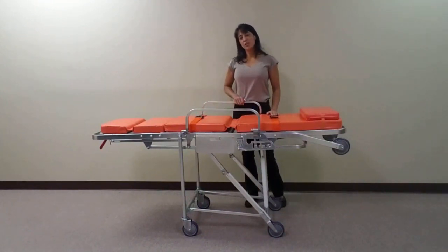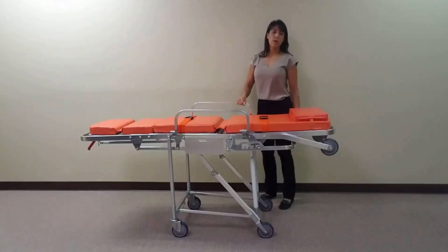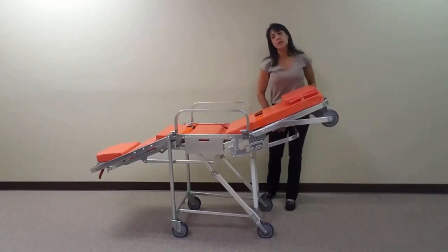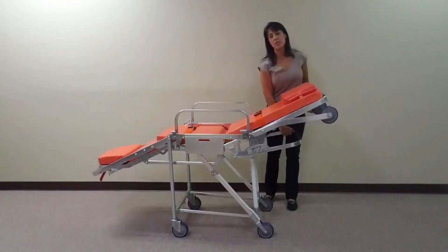Let's take a look at the stretcher's basic functions. To adjust the stretcher into its multiple chair positions, push the horizontal bar located at the head end of the stretcher. There are five pre-set positions on this unit. To adjust, simply push down into the desired position.